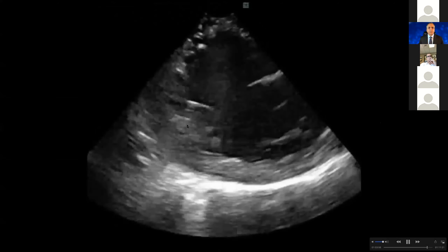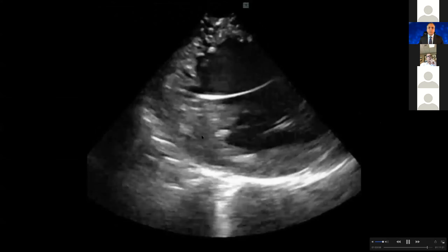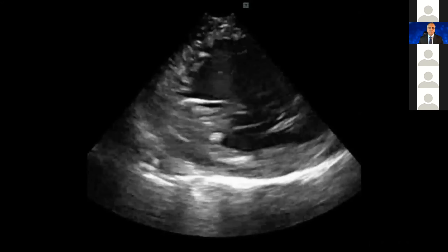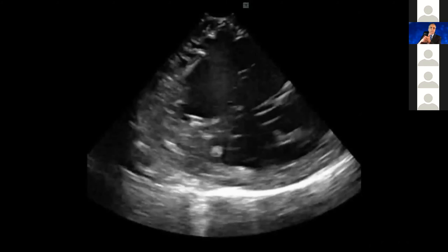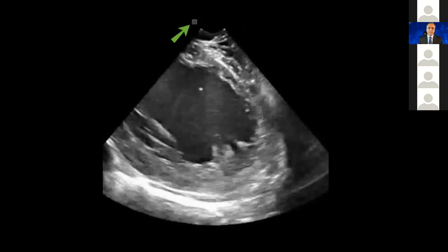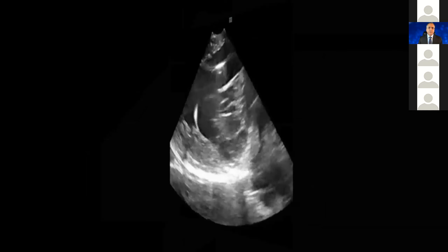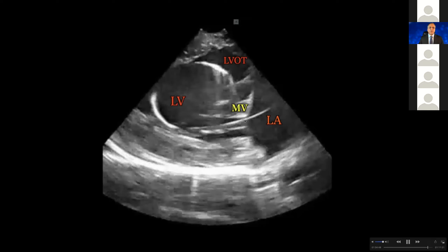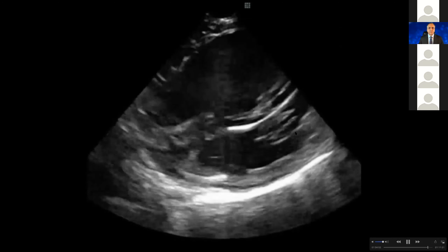The reason I toggle the mirror image — I'm used to the parasternal long axis view of 2D echo, and this reminds me of that, so I understand the view a little bit better: LA, mitral valve, LV, and papillary muscle. Here you can see the anterolateral papillary muscle. As we all know, it's not a good option to go retrograde for the anterolateral papillary muscle, because the catheter is not snug on the tissue — there's a distance between the catheter and the papillary muscle, it's just touching and bouncing back. The best approach would be the transeptal approach for the anterolateral side. Here you can see the left atrium, mitral valve, and the ablation catheter going through the mitral valve in the transeptal approach.